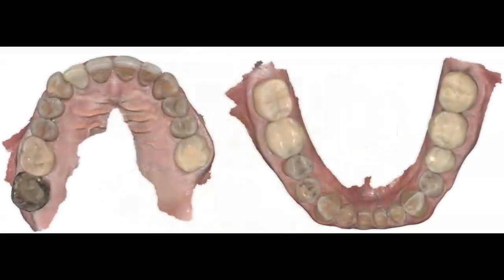Again, I'm showing you the full arch maxillary occlusal view, maxillary scan, and the full arch mandibular scan from an occlusal standpoint. Now, I want you to focus for now only on the anterior guidance. So let's look at the lingual surfaces from canine to canine. And again, I want you to visualize how much attrition combined, as I said before, with erosion is noted on the lingual contours of 7, 8, and 9.